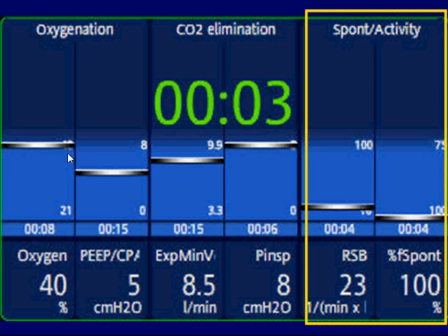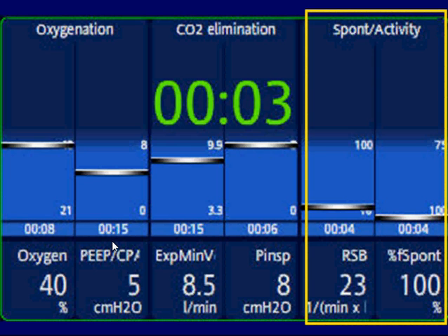These indicators show what's currently going on with the patient and are always moving based on changes you make or the patient's spontaneous activity. There is a timer — when all parameters are in the weaning zone, the timer will go off and show how long they've been there. There are also additional timers in each column to show how long they were in the weaning zone for that specific column.